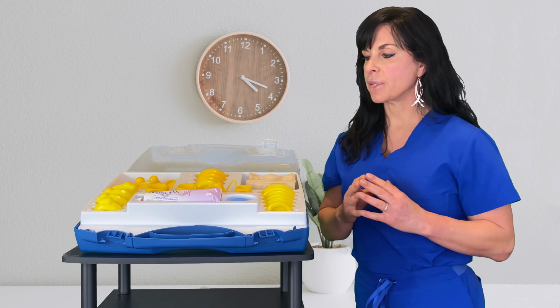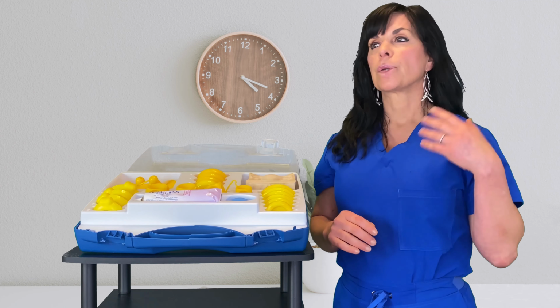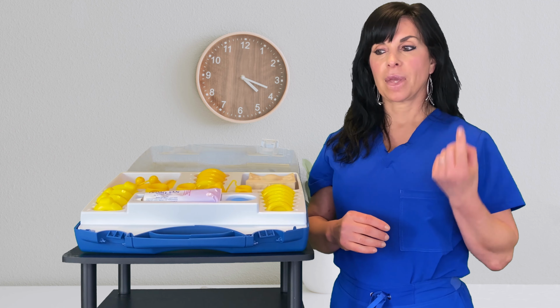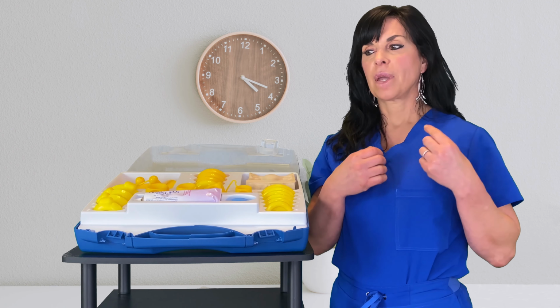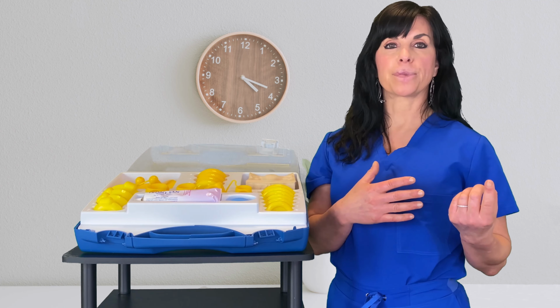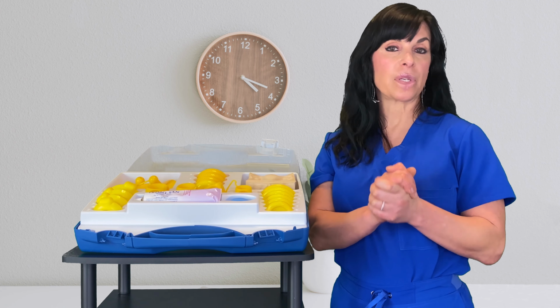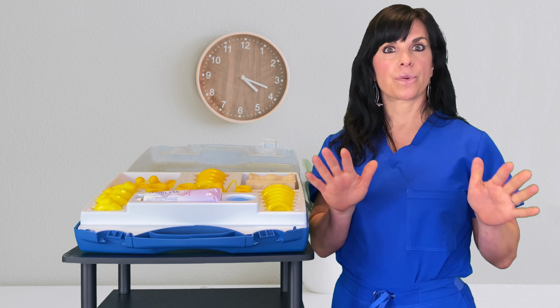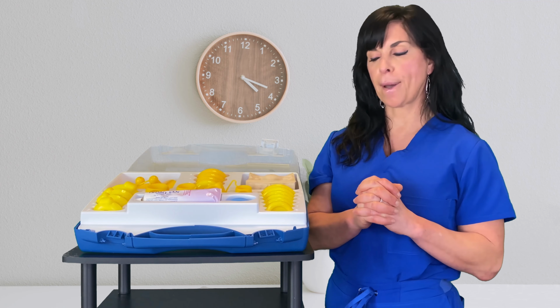The other thing is who really is a candidate. So, number one, if a woman wants to have a child in the future, and she may not want to do surgery because if she gets pregnant, then that's going to put her at risk for developing incontinence or prolapse. So that would be someone who would be a candidate, and she can wear it during the pregnancy too. So if she's leaking during her pregnancy, and as soon as it's over, if she stops leaking, well, that would be just a temporary period of time that she would need to do that.